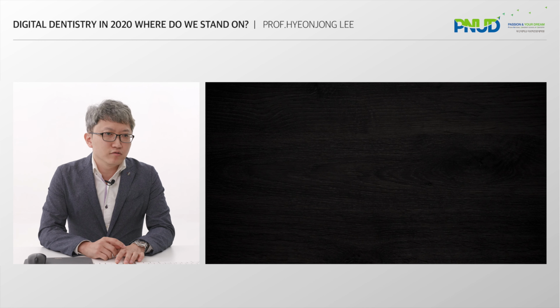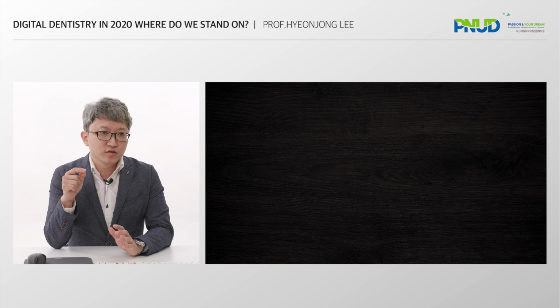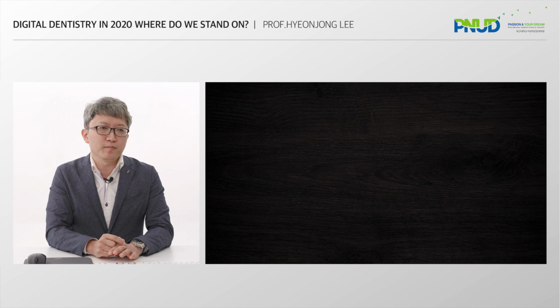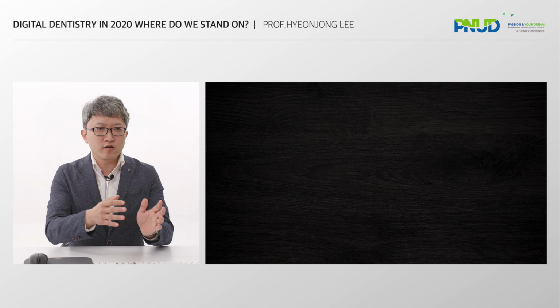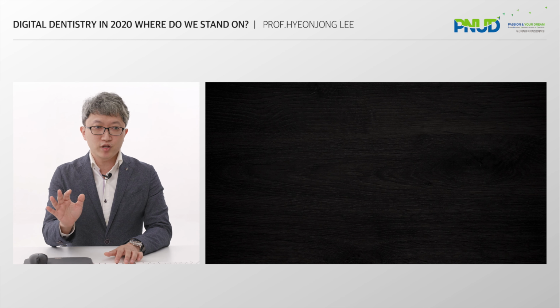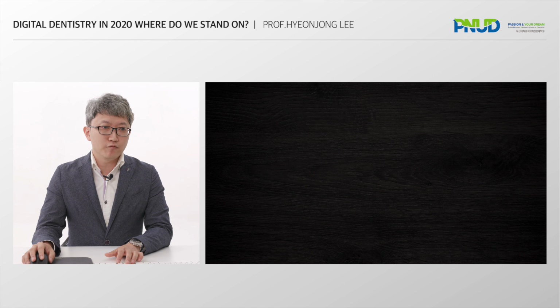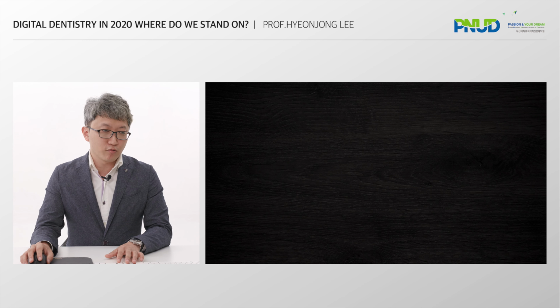Therefore, we may know whether this mean vector is directed towards the center of the platform or outside of the platform. If it is obviously outside, obviously buccal, or obviously on the lingual side of the platform, then we can redesign a bit. And once more, we can analyze the mean vector from the occlusal surface. And from this process, we can decrease torque.